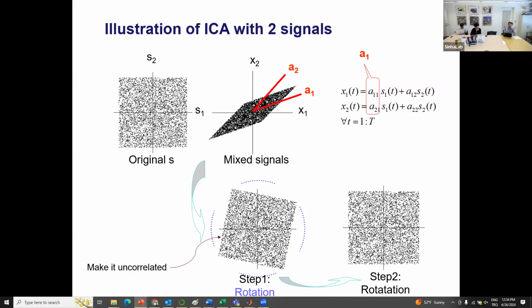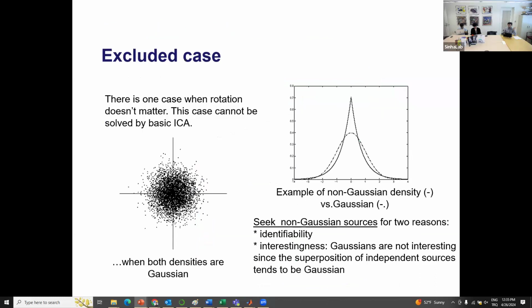For example, if you don't apply any low or high pass filtering, then your signal could have a DC component, and the DC component is basically common to all the channels in your EEG, making them correlated with each other. And therefore the sources could be correlated by the same logic.